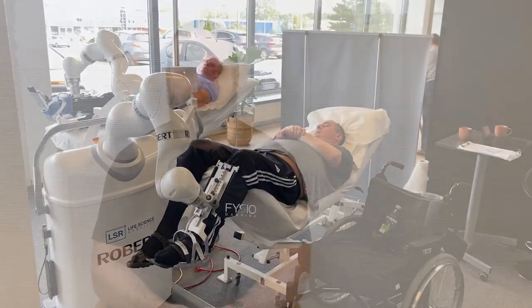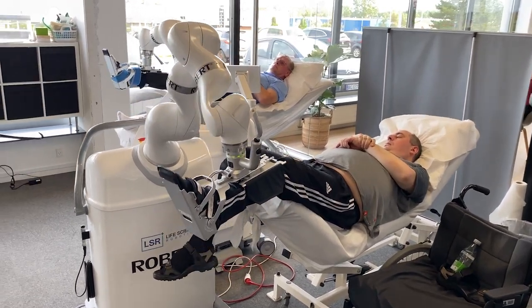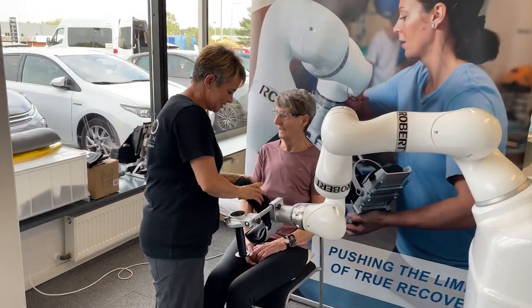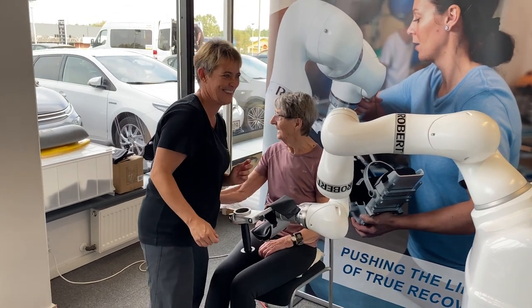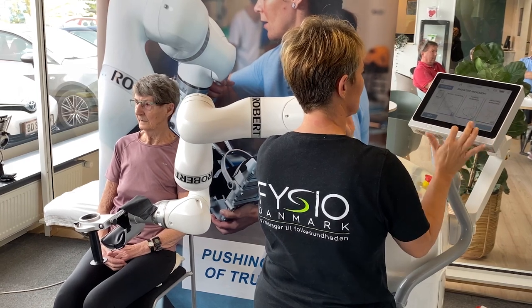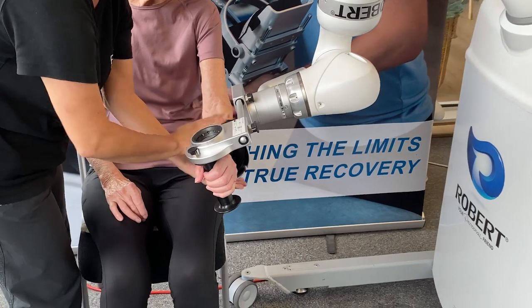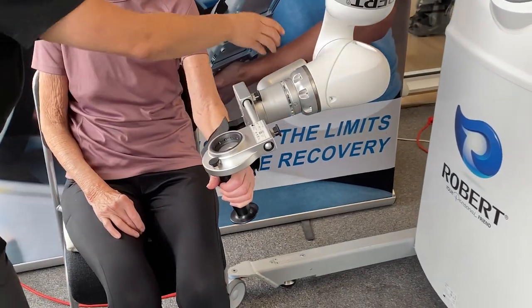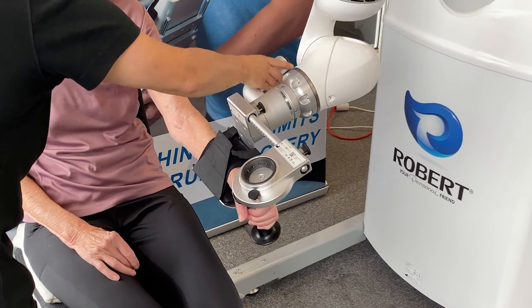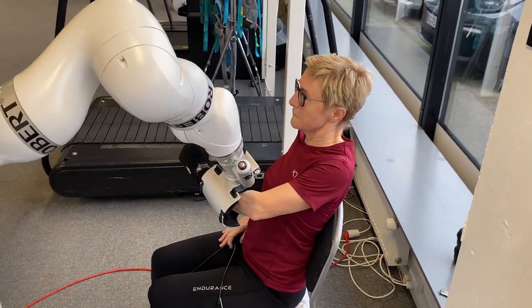Right now in the clinic we have a two-robot setup — two stations where we can train either upper body or lower body with ROBERT. It's been helping us a lot by taking some workload off our backs. We can set up the patient in three minutes, instruct them on what they need to do and how the robot works, and after the initial startup they can just train. It's a three-minute startup and then they can do five or six hundred repetitions in an hour.